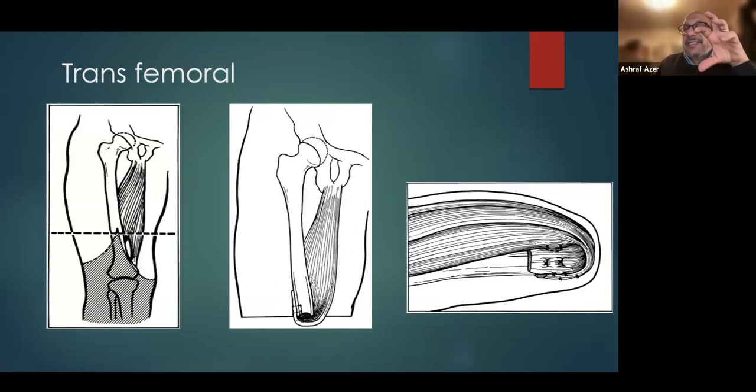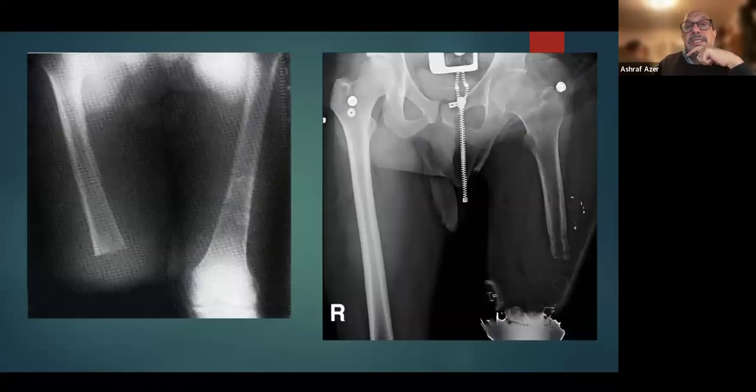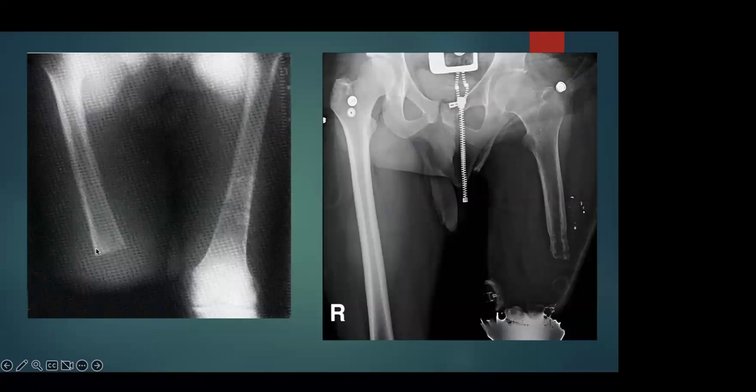I have to say that this specific step has to be judged by the vascular orthopedic surgeon, because if this is ischemic, it's going to be very bulky and can dehisce quite easily. So you have to be careful on what you do. Okay. And when you look at the X-ray, if you have an X-ray viva, you can see here it's kept the balance here. What you call it, muscle balancing.